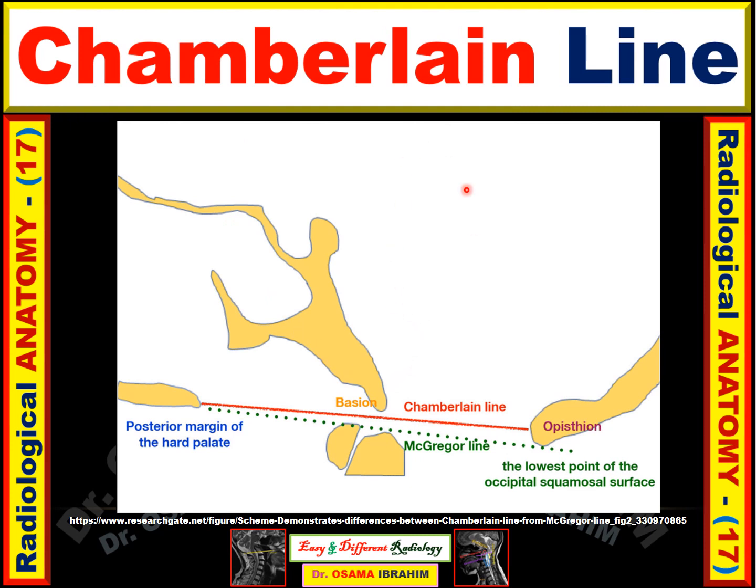What is the Chamberlain Line? Chamberlain Line is a line connecting the posterior margin of the hard palate, like this red line, and the opisthion, which is the most lower and inner margin of the occipital bone. This is a very important line, and this is the definition of the line. What is the importance of this line? I will discuss it in the next slide.